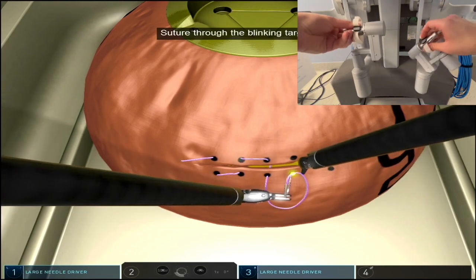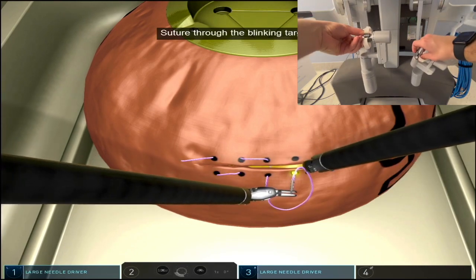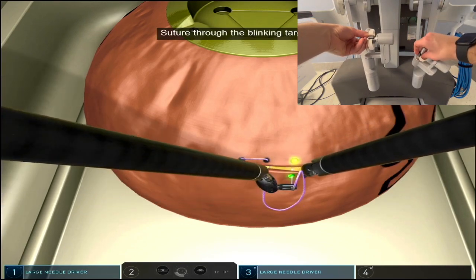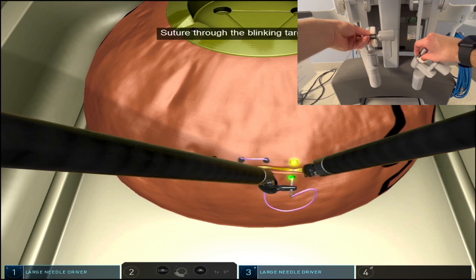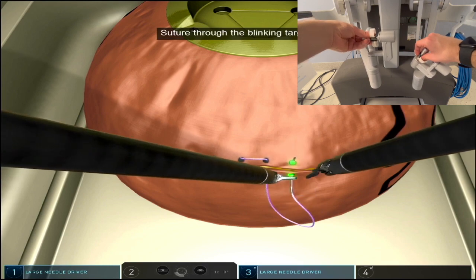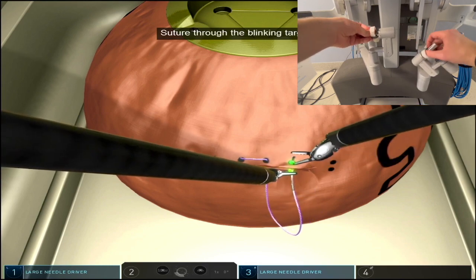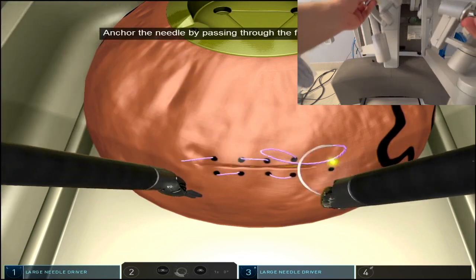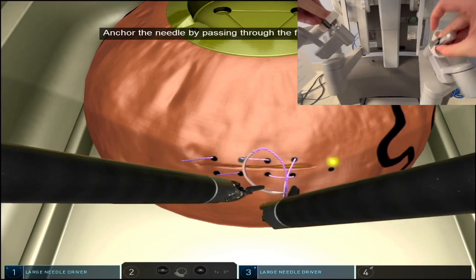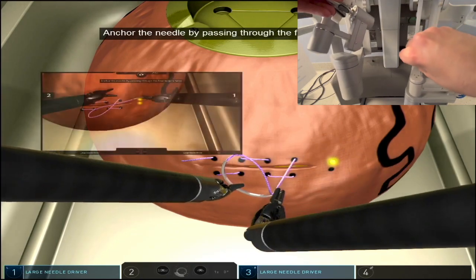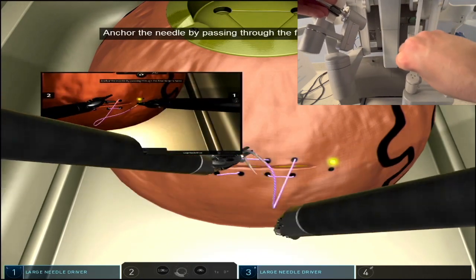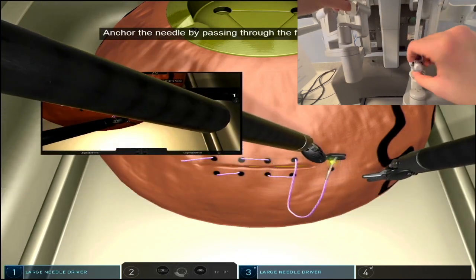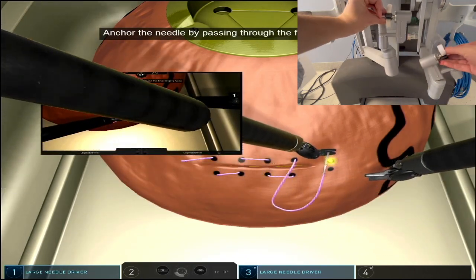A nice rule of thumb is that whenever you're taking bites towards you and you're supinating your hand, it's a lot easier to take both bites in one go, versus when you're taking bites away from you.